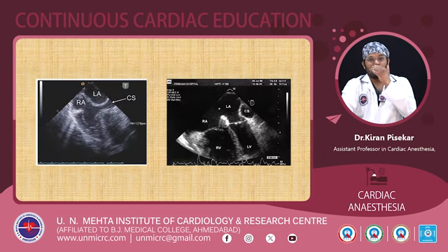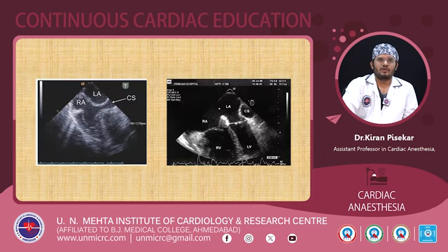Now this is a TEE image. As I have told earlier, we have acquired this image by advancing the TEE probe from the mid-esophageal 4-chamber view. Here we can see a coronary sinus which is dilated. This is a mid-esophageal 4-chamber view. This is a long axis of the coronary sinus. When dilated, the coronary sinus is seen in short axis.